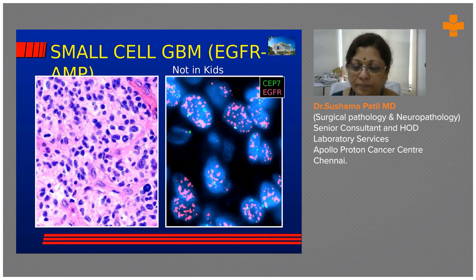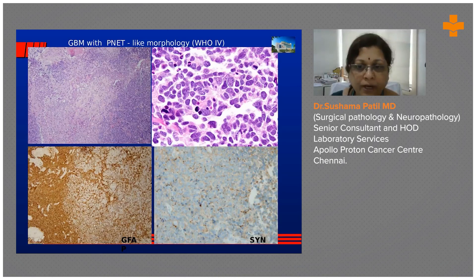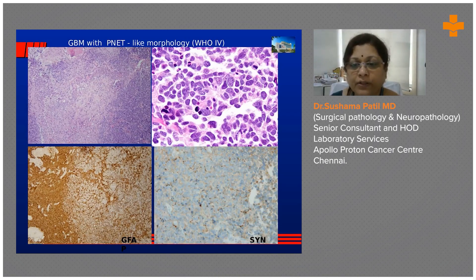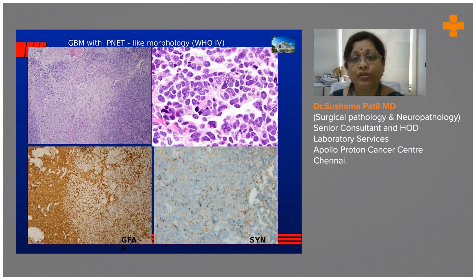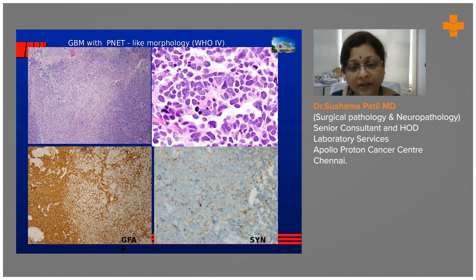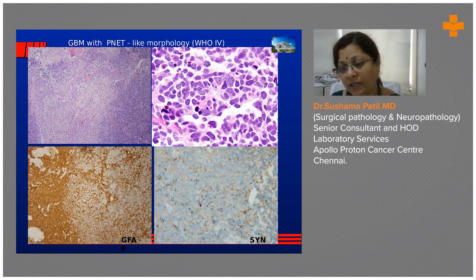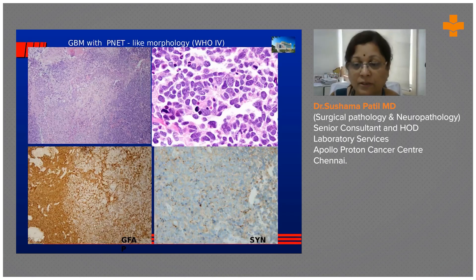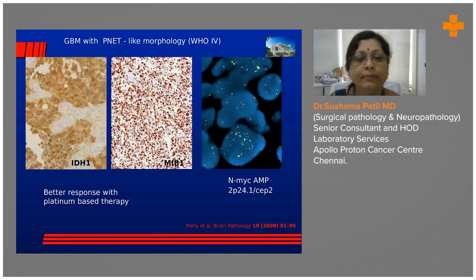Another subtype of glioblastoma shows embryonal features. When conventional GBM starts showing embryonal features, you worry about a hybrid tumor, but there is actually a subset of GBM that shows a PNET-like morphology. Wherever there is a glial component, GFAP — glial fibrillary acidic protein — is positive. But when it transforms into the PNET-like component, it shuts off GFAP epitopes and gains synaptophysin positivity, indicating neuronal differentiation.